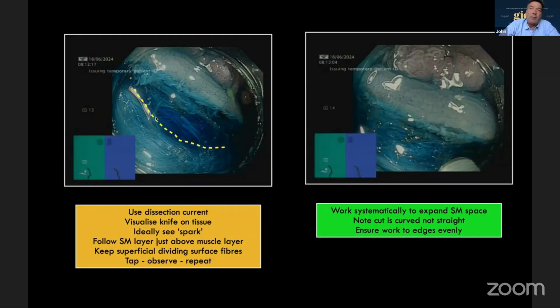But the whole point of doing an en-bloc resection is that you get an en-bloc pathological specimen. And if they're going to look at this, they need to look at all three SM layers. It's normally divided into SM1, SM2, SM3. Anything beyond SM1 is deemed invasion and it's probably incomplete. The trouble is you destroy SM3 with your knife, so all you're left with is SM1 plus a little bit of SM2, and that's what your pathologist is looking at.